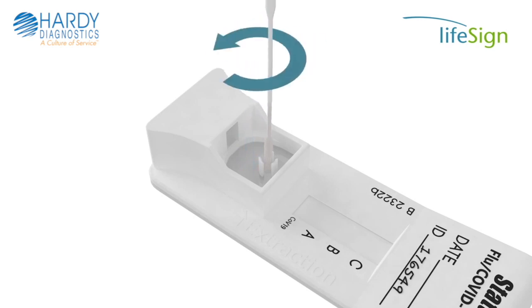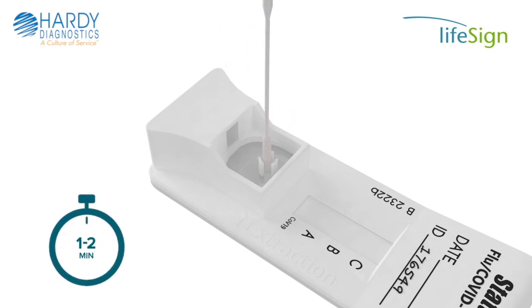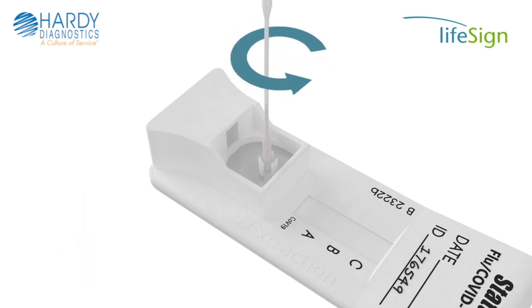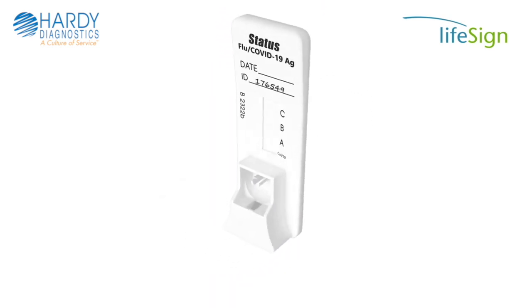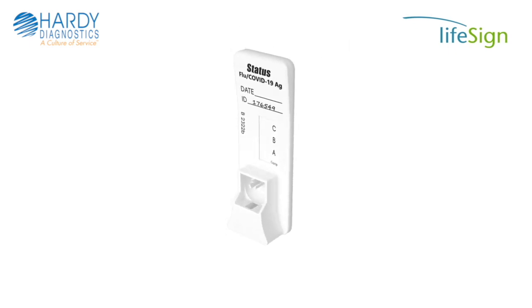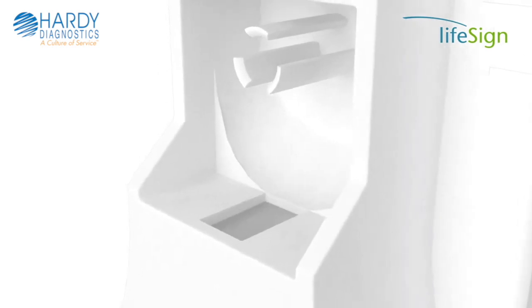Rotate the swab three times in the same direction to mix the sample. Allow the swab to stand in the device to incubate and set a timer for one to two minutes. Then rotate the swab again three times. Remove and discard the swab. Slowly raise the test device on its flat end to an upright position and allow to stand for one to two seconds. Gently tap the cassette on the counter to ensure all of the liquid flows from the extraction well into the hole of the test device.